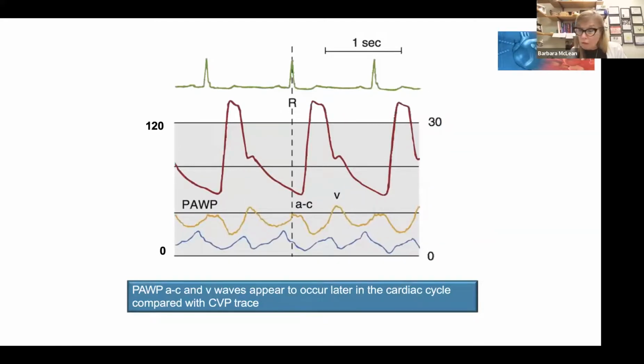It's the only catheter you'll ever use, the only one that's ever been developed that can move from arterial pressure monitoring to venous pressure monitoring simply by inflating the balloon, allowing the catheter to sail forward, and from the very distal tip of the catheter looking forward at the venous column of blood as it transitions to the left atrium and left ventricle. Fantastic. But remember what I said before, everything we talked about with venous pressure is exactly the same on wedge pressure as it is on CVP.